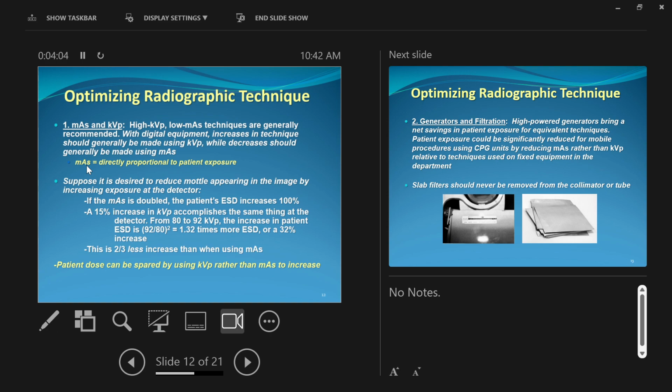I need someone who's not shy about getting their thickness measured. You want to volunteer? All right, Enrique volunteers to get his thicknesses measured. We'll measure AP thickness just for his lumbar spine area. By the way, this is a caliper. This is used to measure body thicknesses. It measures in inches or centimeters. We'll use a centimeter measurement.